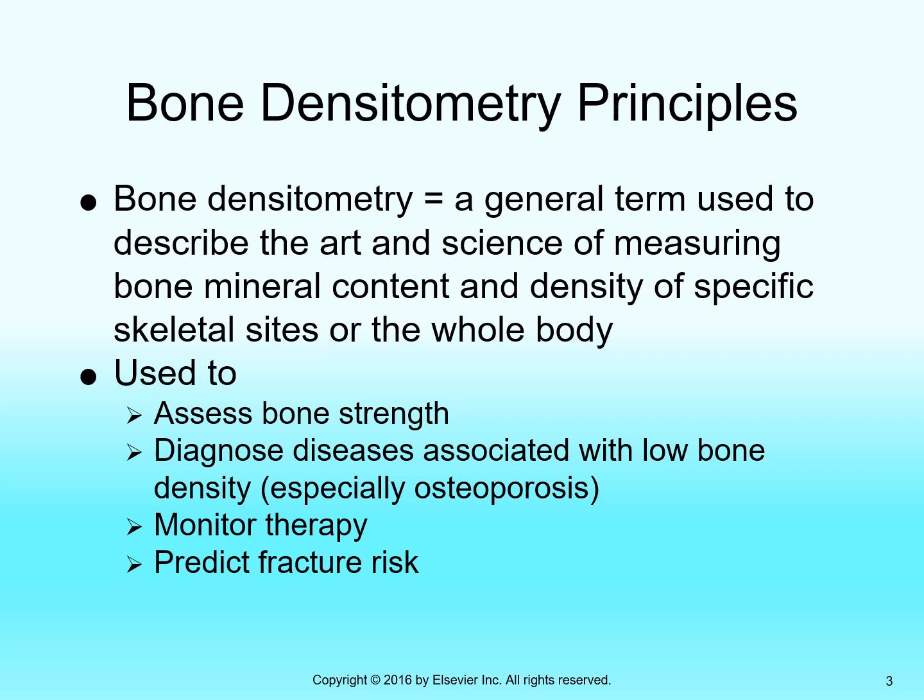And then we can follow up on the treatment for osteoporosis with periodic reassessments of the same tissue in the same patient. We can track whether the medical interventions, such as prescribing calcium supplements and certain hormone therapies, are effective in this patient, or whether different interventions are necessary. That can be assessed with follow-up bone densitometry and tracking a single patient over a long period of time.